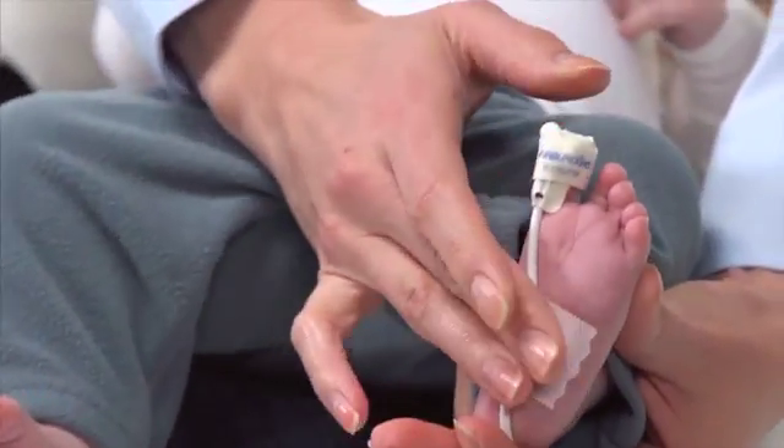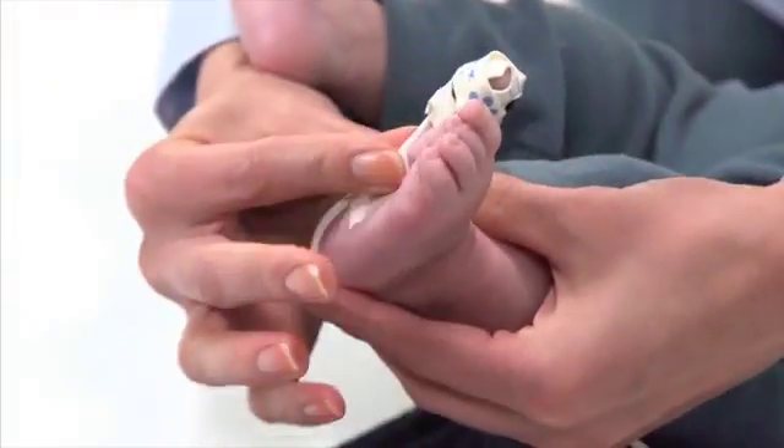It's a good idea to gently secure the sensor cable independently from the sensor along the bottom of the foot toward the heel.